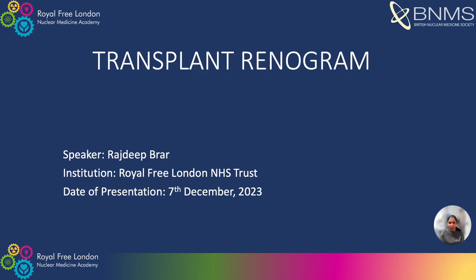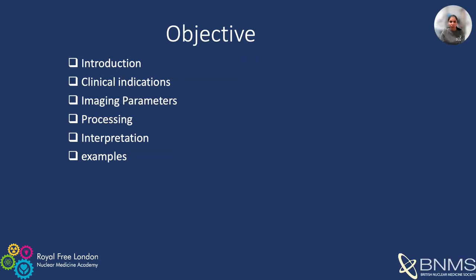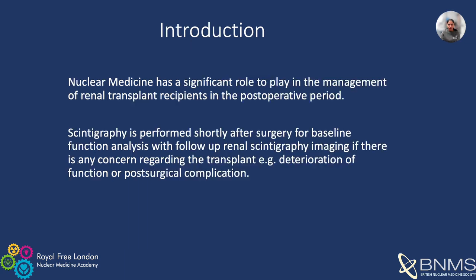Today, I will be talking about transplant renogram acquisition and processing. We'll be covering clinical indications, imaging parameters, processing, interpretation, as well as a few examples to show how we are doing it over here. To begin with, nuclear medicine has a significant role to play in the management of renal transplant recipients in the post-operative period.